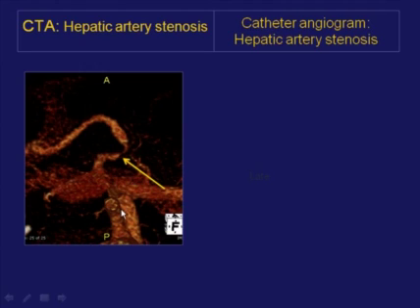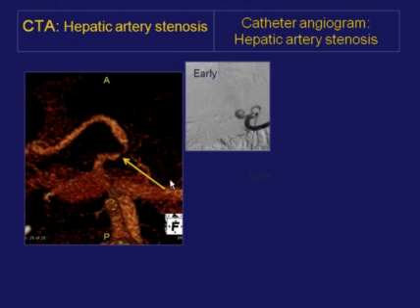And these are the reconstruction from that study. You can clearly see that there is a stenotic segment and post-stenotic dilatation. As a result, the patient went on to have a catheter angiogram. Here's the catheter, and you can see an interesting phenomenon.